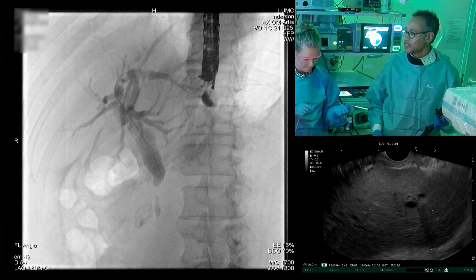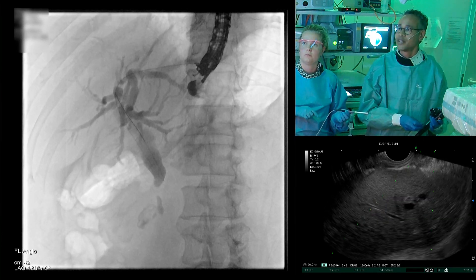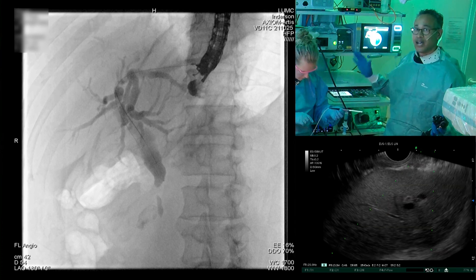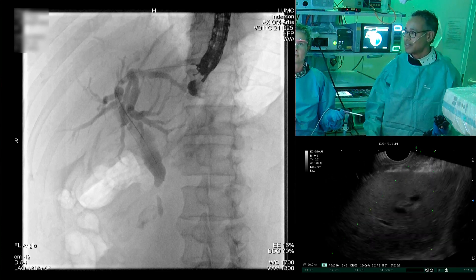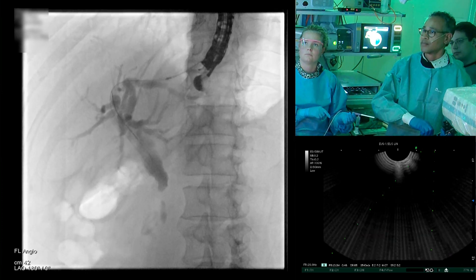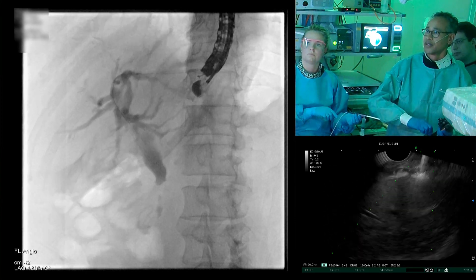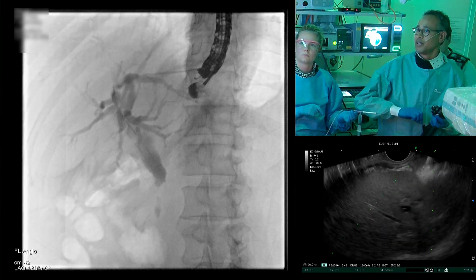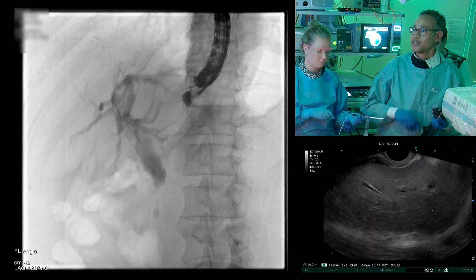We passed the cystotome up until the level of the gastric wall. Under fluoroscopy, you can appreciate that the guidewire is still in and the catheter is just a little bit outside the working channel of the endoscope. With our ERBE we use cystotome settings. It's now inside. I'm going to try and move the cystotome further down — it may be that it's just lodged in a small bile duct. But it's going down now into the distal bile duct.